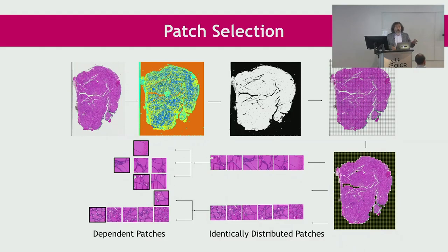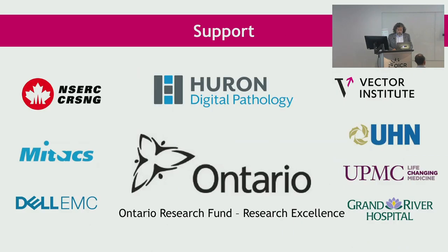Whatever is in lung and breast and prostate is most likely benign if you have a large database. If you're talking about 500,000 scans from all body parts and you see a pattern in all of them, if it is everywhere, it is most likely benign. Maybe it's fatty tissue. Everything that is special and not very frequent is most likely not benign. We are, again, talking from the perspective of the computer.